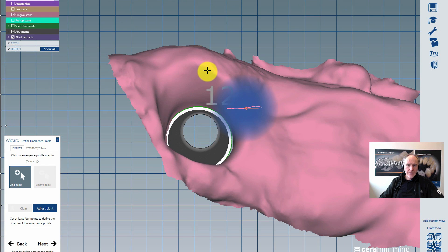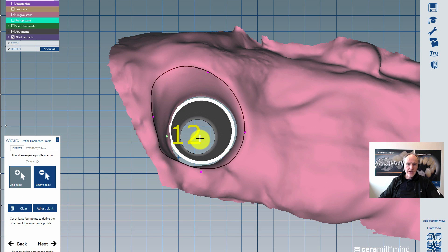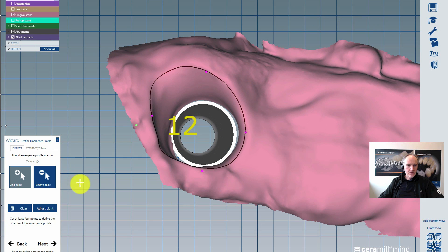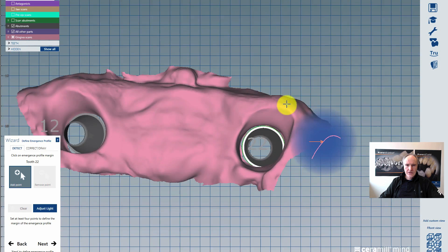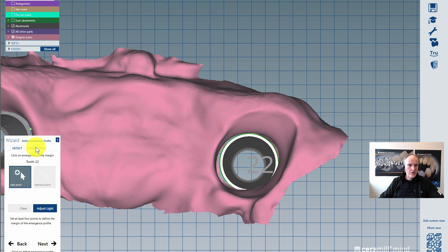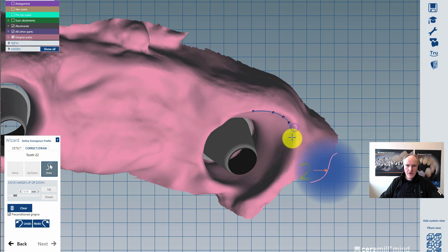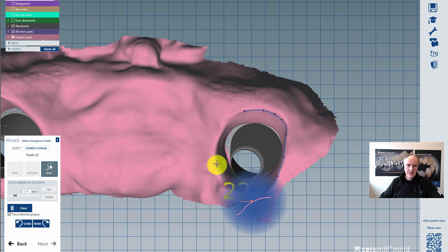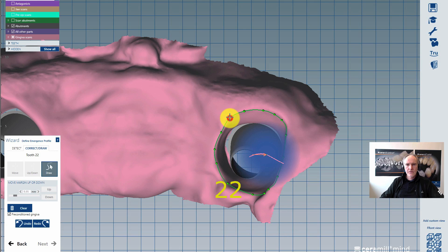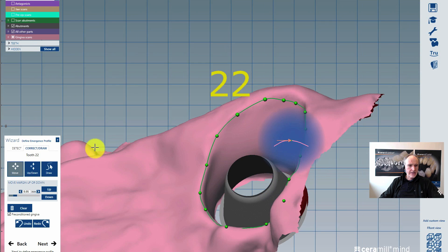In this part I am creating my profile on the gingiva all along here. It's enough to have 4 clicks. Then you click next and take the other one. It's also possible to go to 'correct and draw' and make it with single clicks, so you can click along your profile. Sometimes it's better to have single clicks rather than the automatic 4-click method. If necessary you can correct these control points.